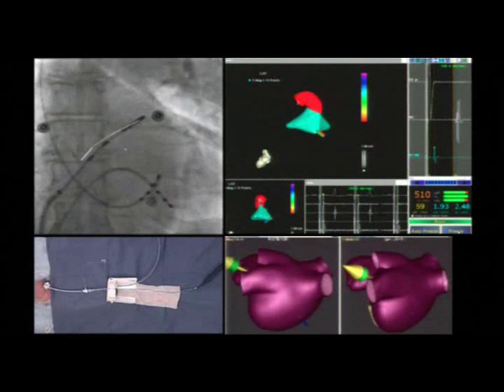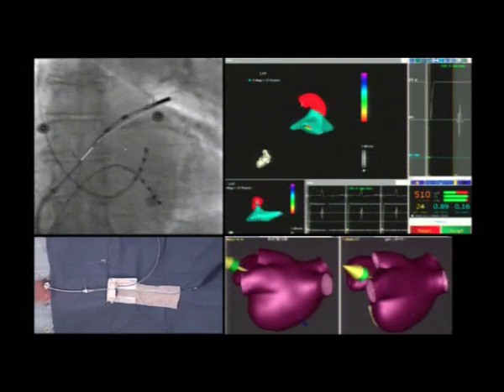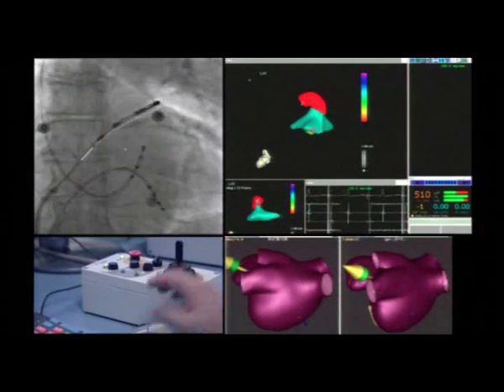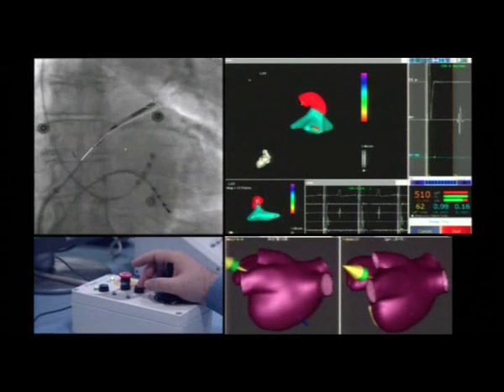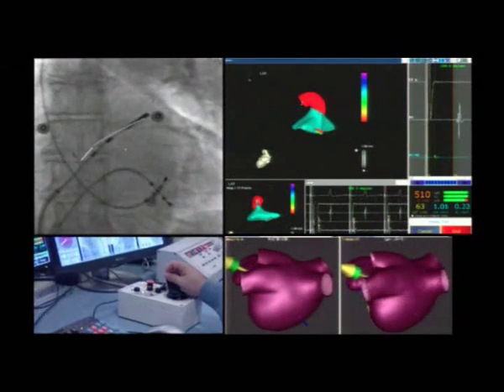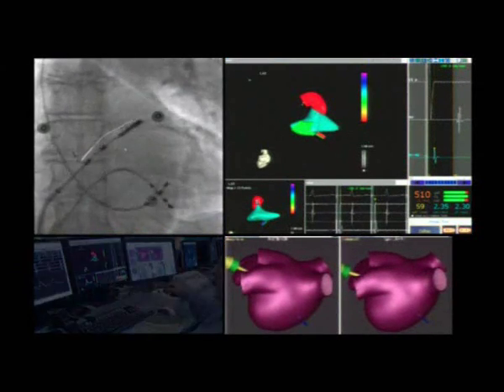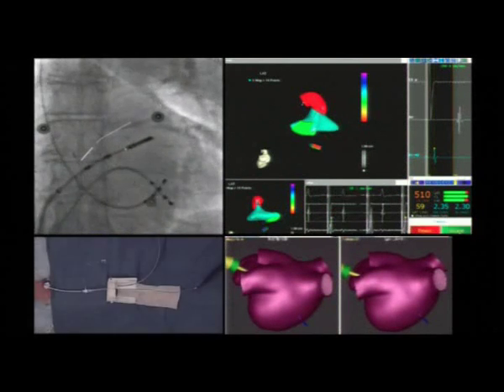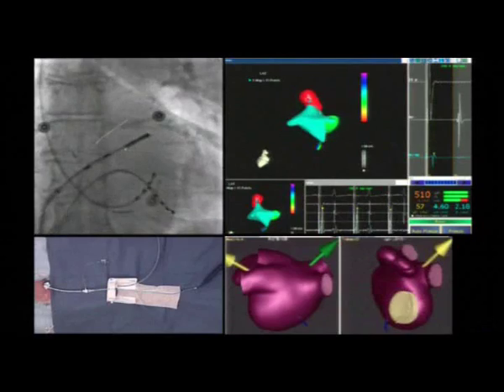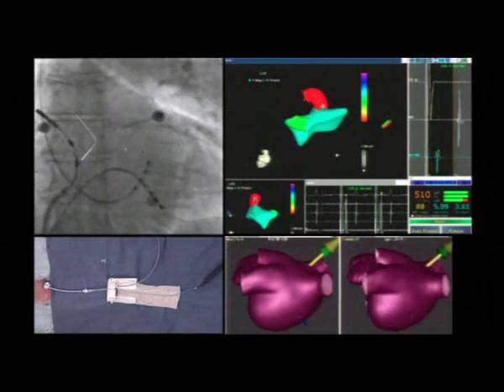On the Carto screen you can see the reconstruction of the left superior pulmonary vein in red. The reconstruction of the pulmonary vein can be rapidly obtained by using the preset system for each pulmonary vein in 90% of cases. This system has preset vectors memorized that allow the catheter to be moved inside the pulmonary veins automatically. If necessary, the reconstruction can be performed remotely by the operator, which can rarely occur for the right pulmonary veins.